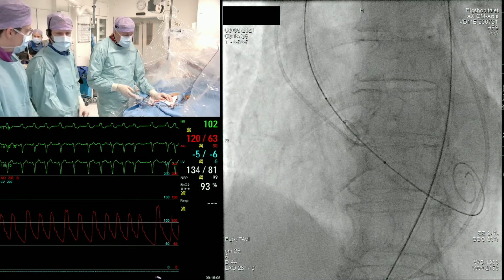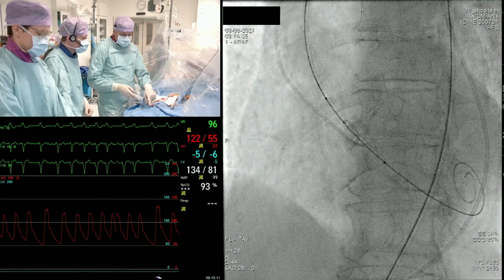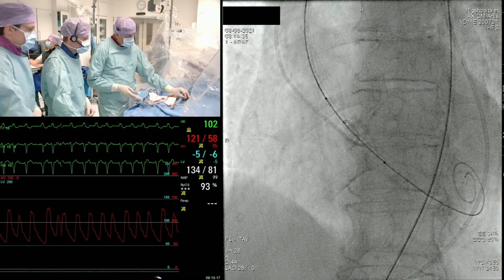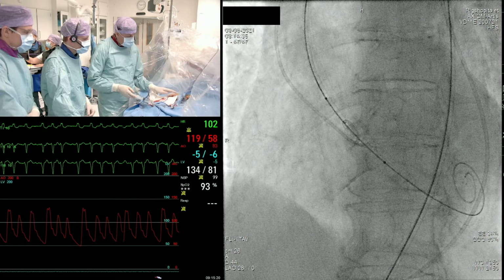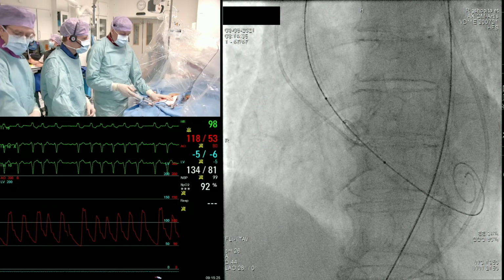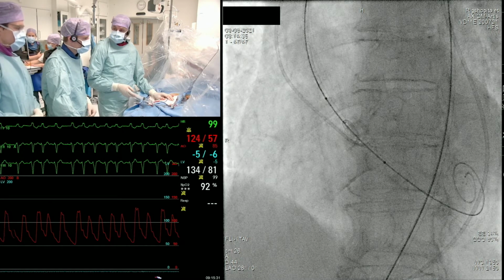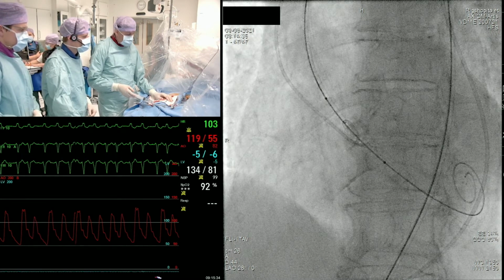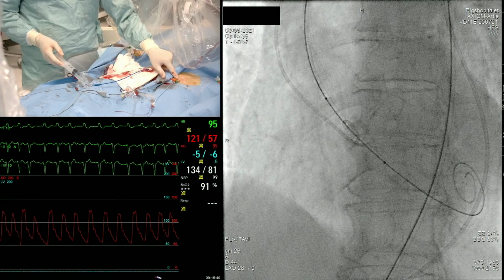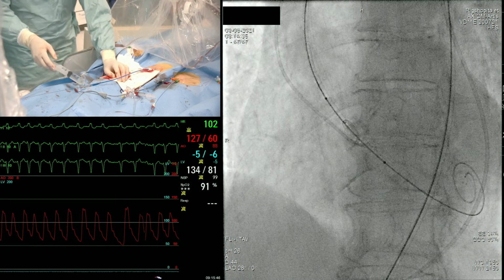As we said before, we're going to pace what we call LV pacing. We're going to pace on the stiff guide wire. One crocodile electrode here is on the guide wire down here, and the other one on the short guide wire in the femoral vein. Of course, you need to have some kind of isolation on it, a balloon catheter, a delivery catheter, or a standard catheter. Otherwise, it's not going to work. So let's say that the patient is going to develop complete heart block during balloon dilatation or valve implantation. We have to put a needle in here, move the crocodile to the needle, and insert an RV pace lead through the catheter here. But let's see how this is going to work.